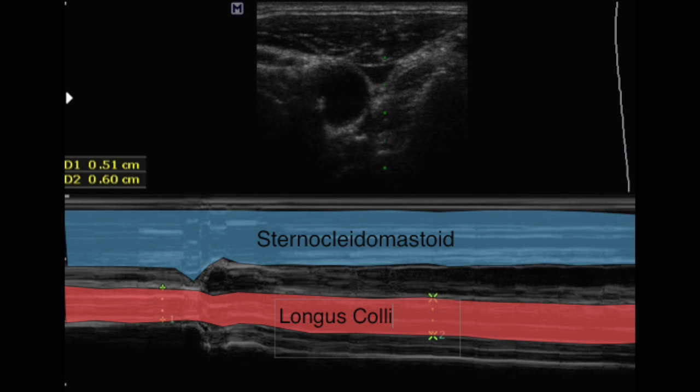The superficial sternocleidomastoid can also be simultaneously assessed to gauge whether the intensity of the exercise is appropriate.